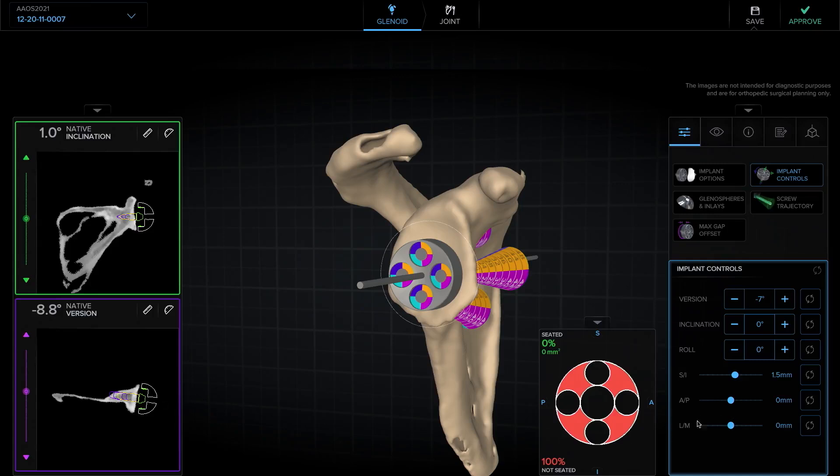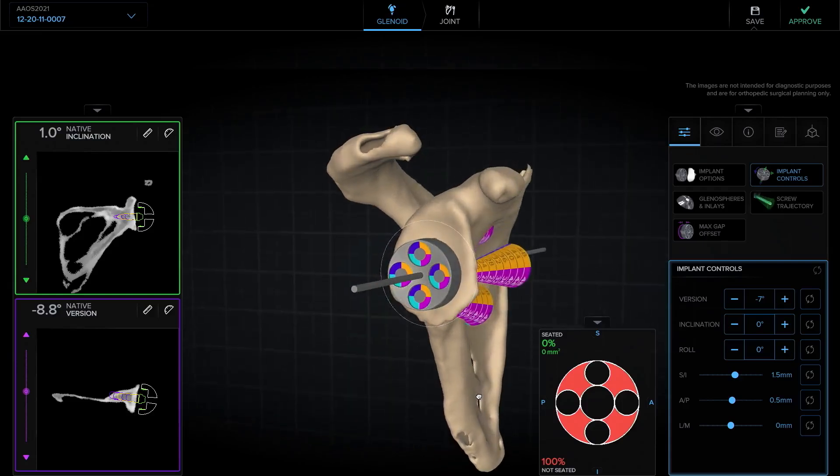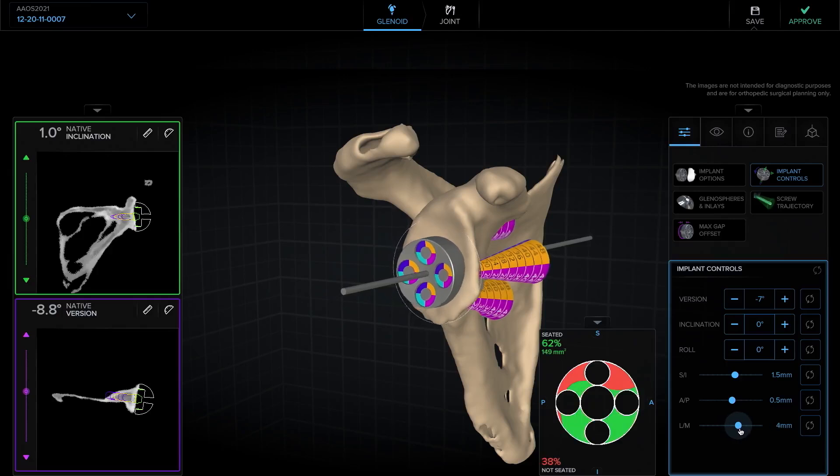We can also, on this axial view, adjust the anterior or posterior position of the base plate. I typically like to center it as best I can, and it looks pretty well centered. Finally, we can adjust our depth and move it lateral or medial until we get good backside seating. I'm shooting for close to 100% backside seating, but I'm not necessarily committed to 100%.